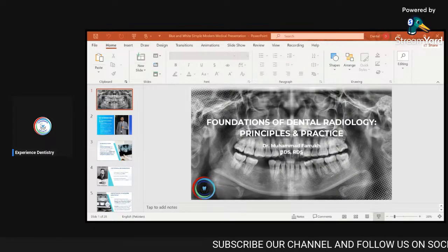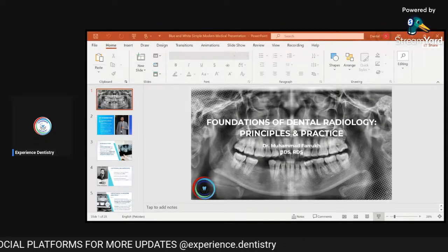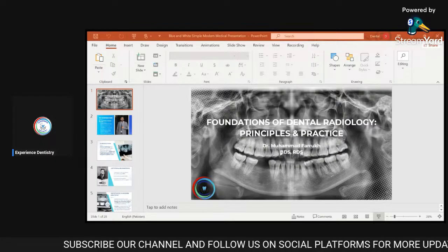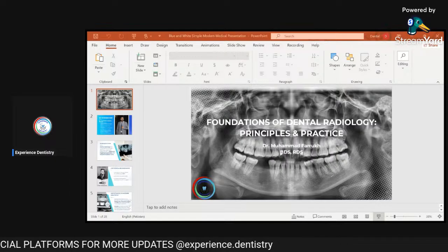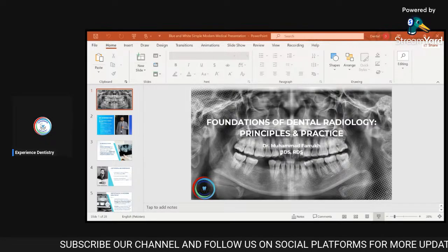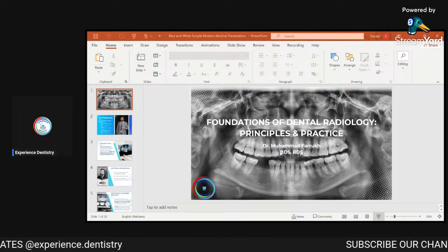Thanks to him. In our modern era, what types of dental X-rays do we have, and how much have we progressed from plain film, the old printed form of X-rays? Now we have many new types available, such as panoramic imaging, digital OPGs, and digital X-rays, and the new one now being used for dental implants, which is CBCT. CBCT is more precise and efficient. It is used in the implant industry and helps in assessing bone height and bone quality before placing an implant, to reduce the risk of complications afterwards.